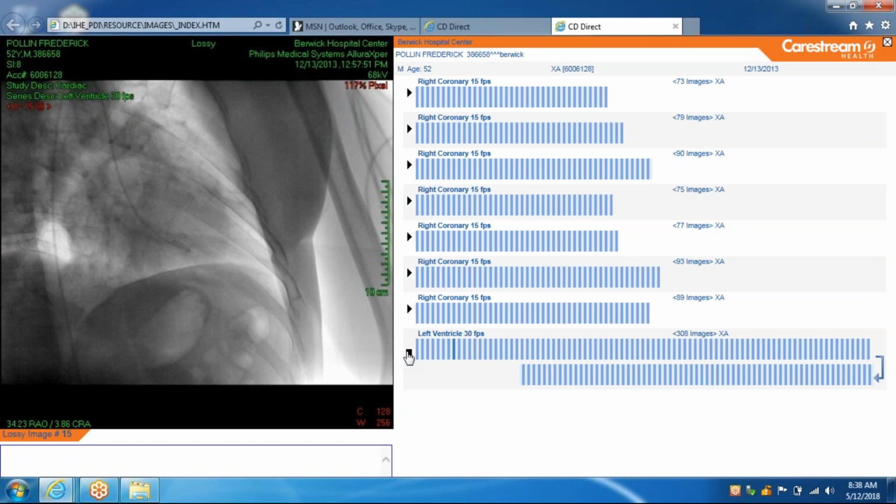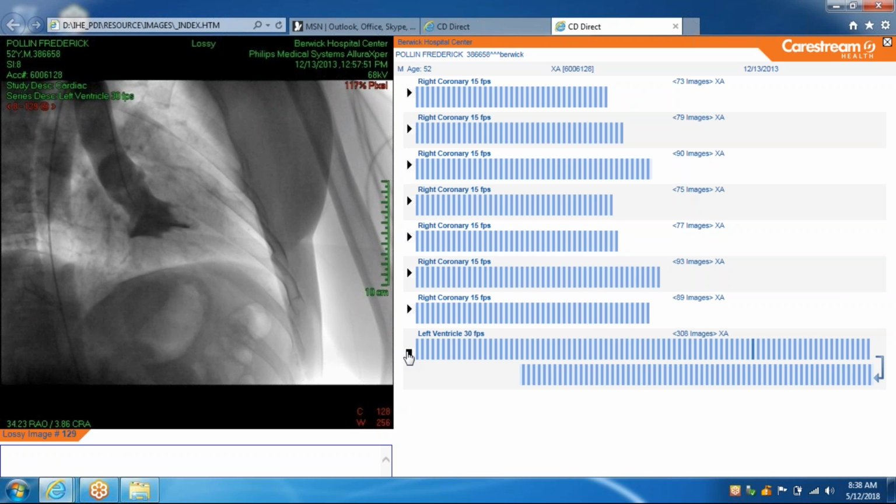Okay. So with the catheter in the LV, you just inject the dye, and then the LV will pump the dye out, and you can determine the ejection fraction. So this is fairly decent. You inject your dye, and you see how well the LV pumps the dye out. It doesn't appear to be any significant mitral regurgitation.